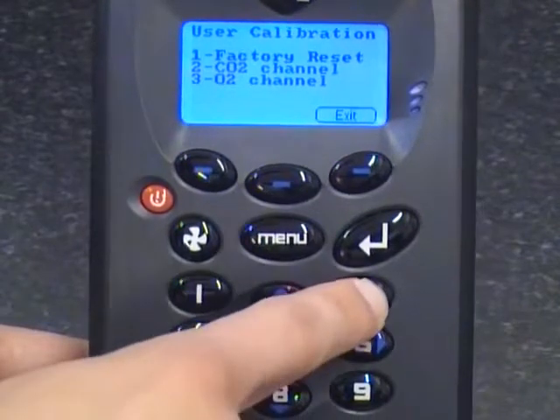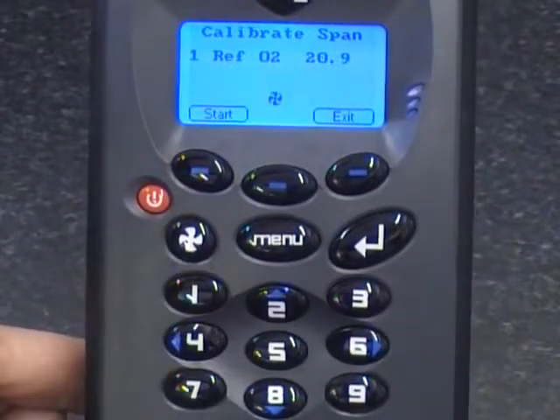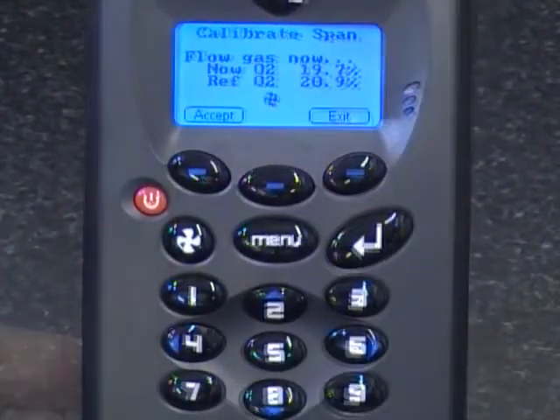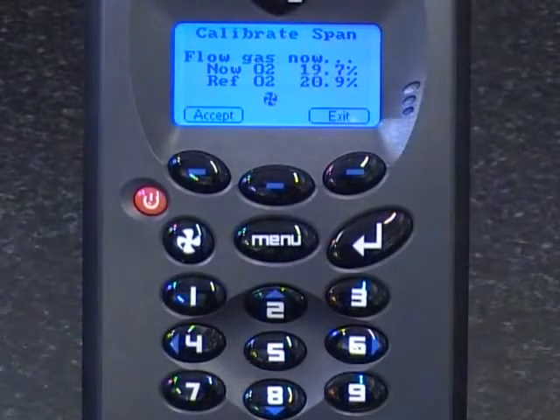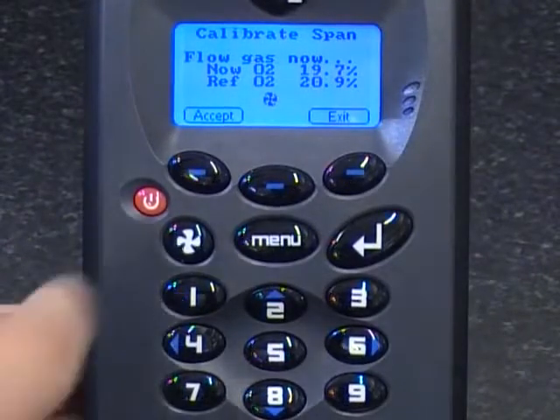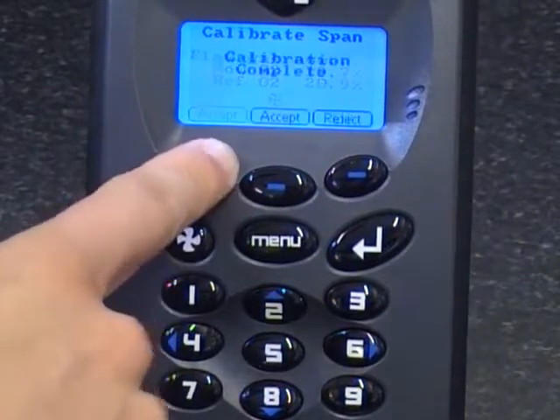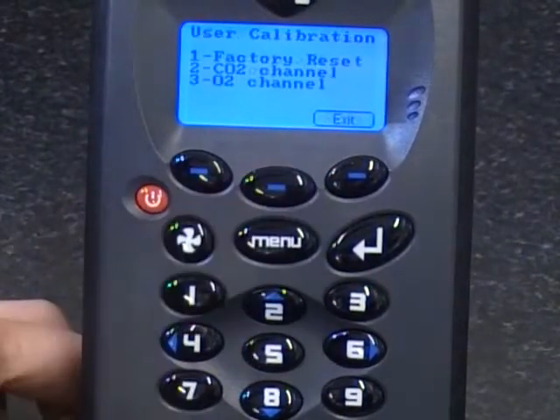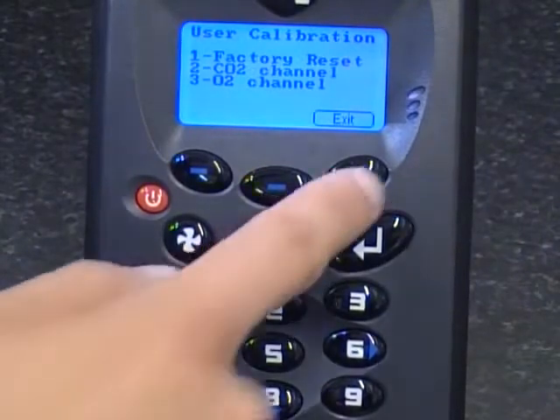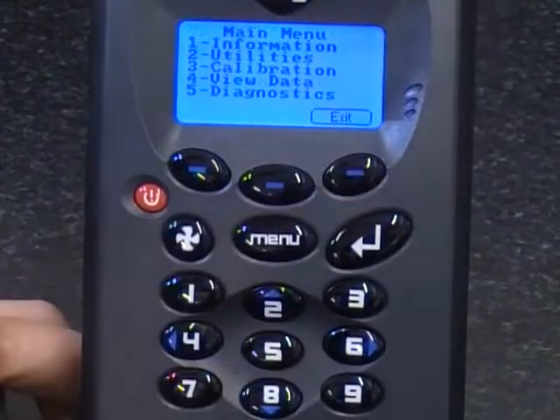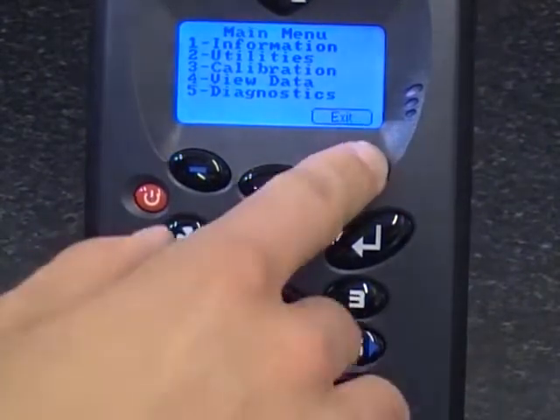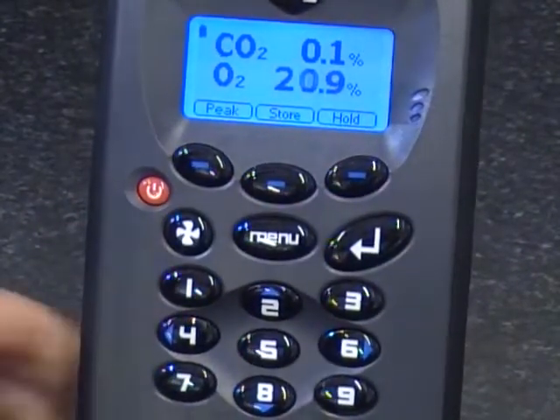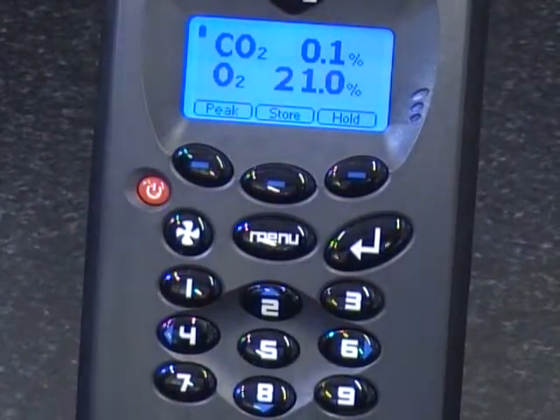Then press the start button and wait for the reading to stabilise. Once the reading is stabilised, press the accept key. Press the accept key again to store the calibration. And then you have calibrated the CO2 and the O2 channels successfully.